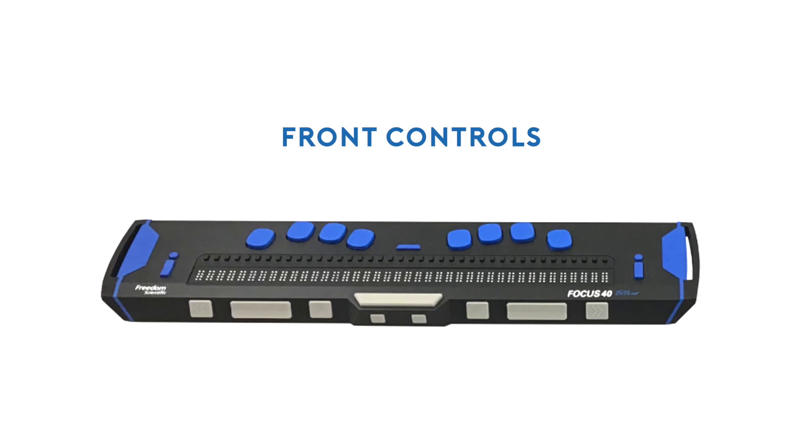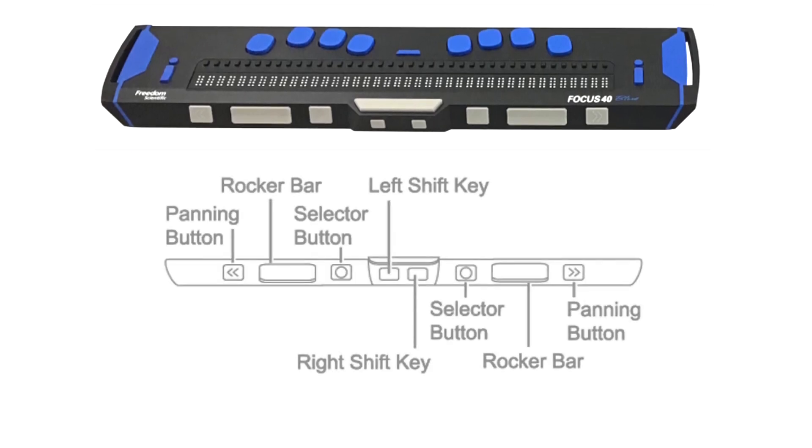Notice that the controls on the front panel of the Focus 40 Blue are arranged in a symmetrical pattern. The controls on the left side are a mirror image of the controls on the right side. At the extreme left and right ends of the front panel are the panning buttons. Pressing them allows you to pan backwards and forward through a file or document. Moving inward are the left and right rocker bars — long horizontal rockers. Pressing the top or bottom edge allows you to navigate up or down a line at a time through a file or document.